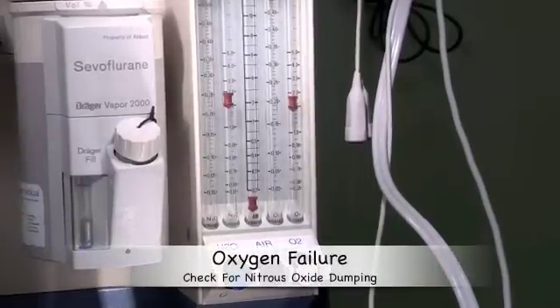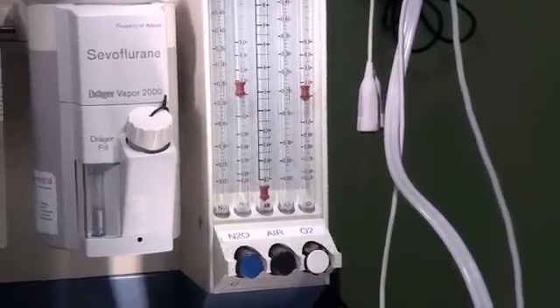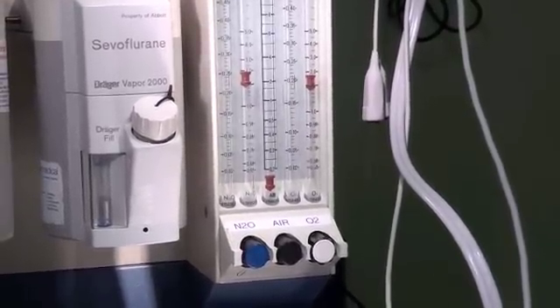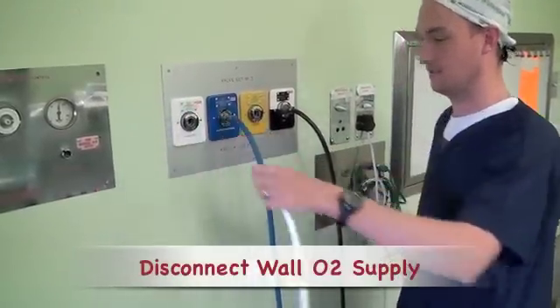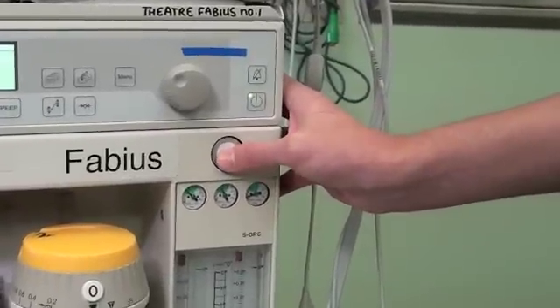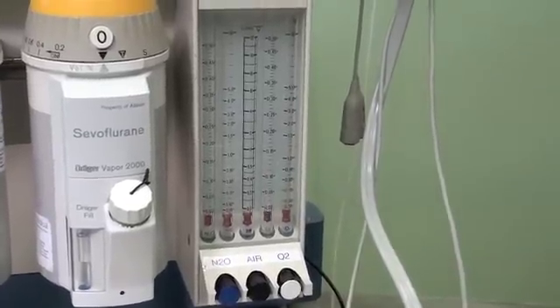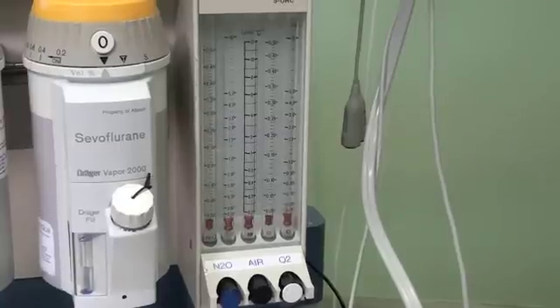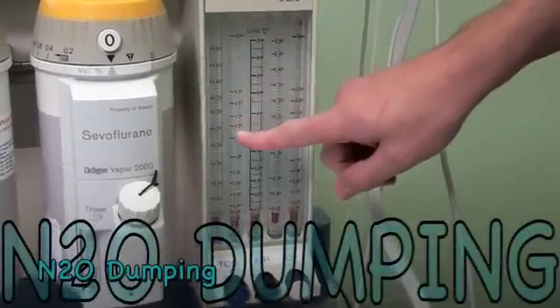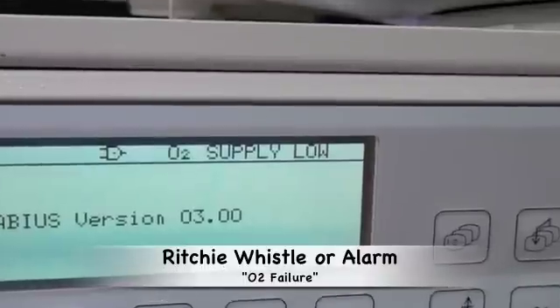In the event of a failure of oxygen supply to your machine, it is essential that the nitrous oxide supply is also stopped. This can be tested by disconnecting the oxygen supply from the wall. One can speed up the process by pressing the oxygen flush button, which empties the machine of oxygen. The machine then alarms because the oxygen supply has been terminated and dumps the nitrous oxide that was flowing. Depending on the anaesthetic machine, you will either hear a Ritchie whistle or the machine will alarm.